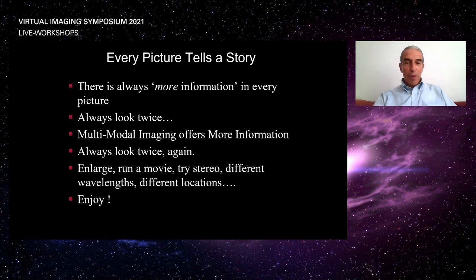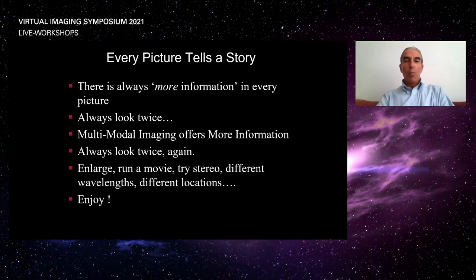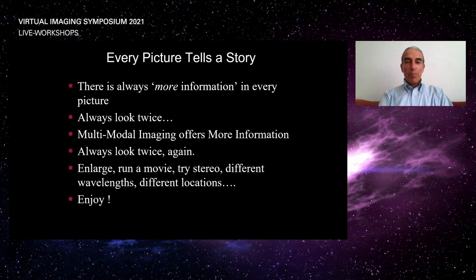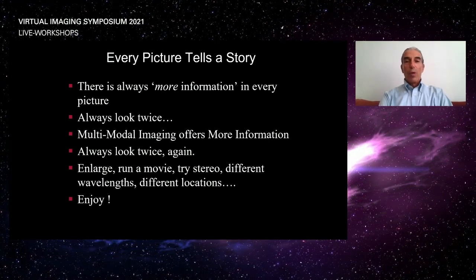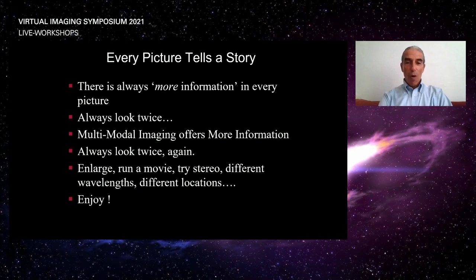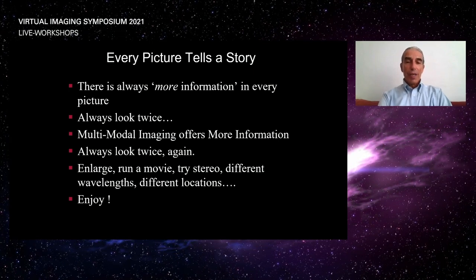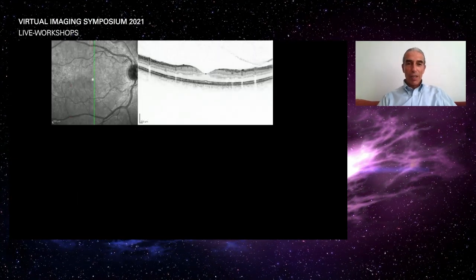The second thing to remember is that every picture tells a story, and we should always look more and look twice and look to the right and left and look a little deeper and a little higher, because as busy as our clinics are, if we take another second or two, we will come upon a new revelation which enables us to get more information and, of course, better treatment for our patients. Run movies, enlarge, basically be inquisitive, and most importantly, enjoy every session.